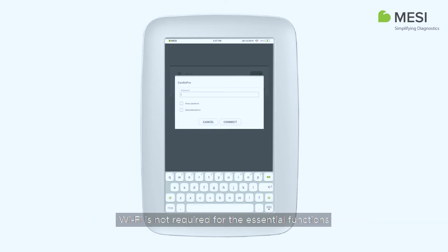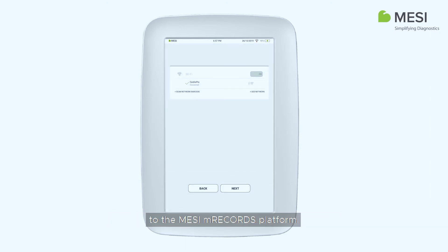Wi-Fi is not required for the essential functions of the Macy M-Tablet, such as performing measurements, but it is necessary for measurements to be synced to the Macy M-Records platform.